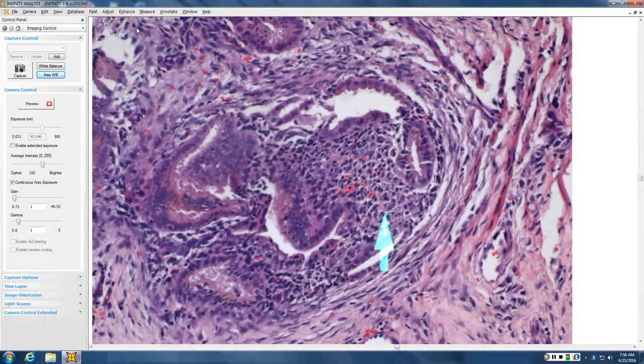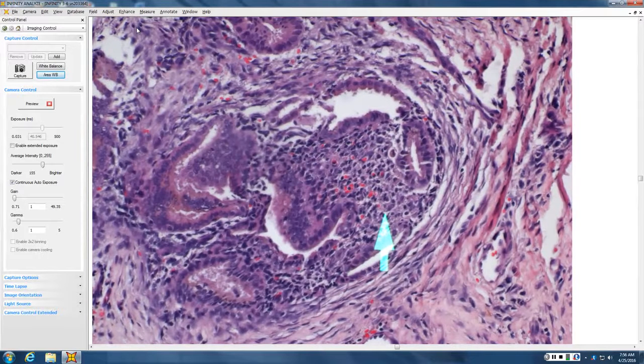Anyone else want to jump in with what this may be? Endometriosis. And endometriosis is one of those things that simulates metastasis, so it's very important in the differential, and we see it not uncommonly in skin. So with endometriosis, you're going to get a secretory columnar epithelium that looks almost apocrine because there's a little snouting or blebbing off the top.